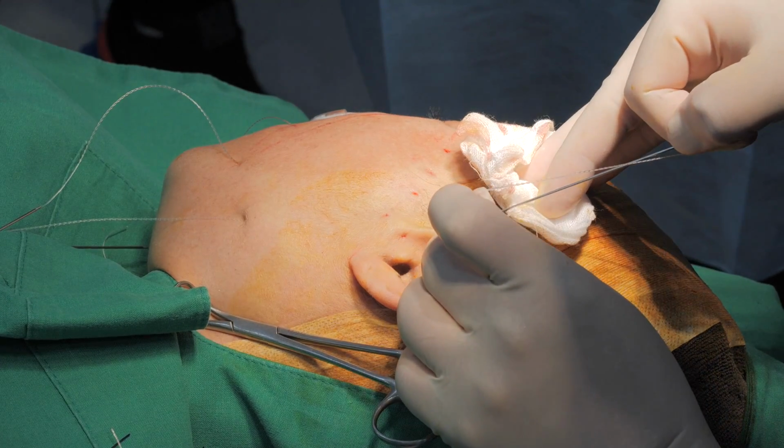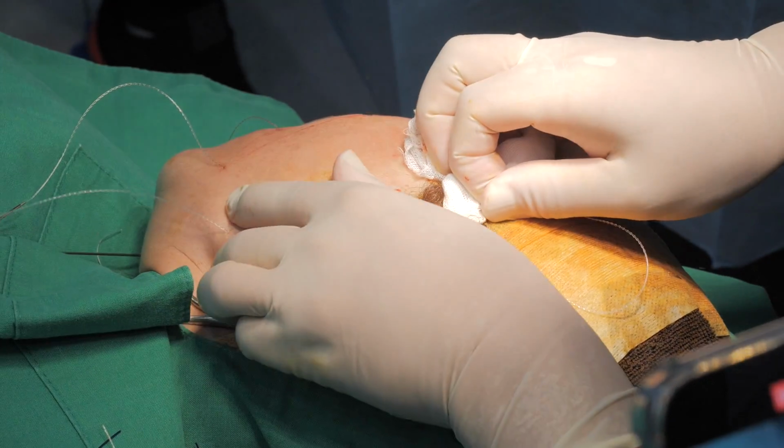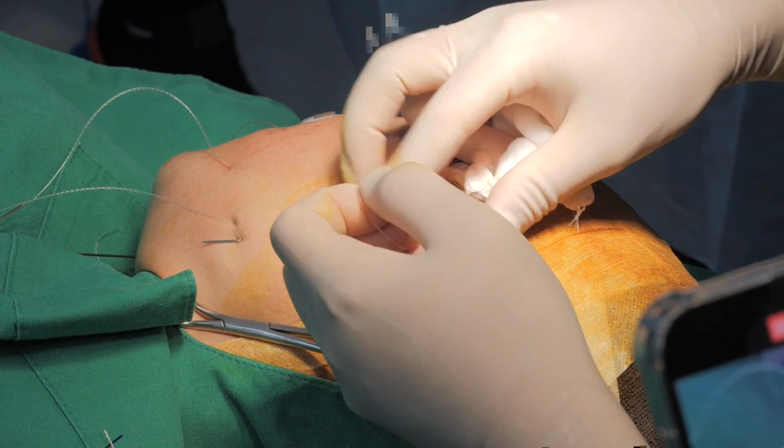Please stop using mono thread. It's out of fashion. I've never used that kind of thin thread.